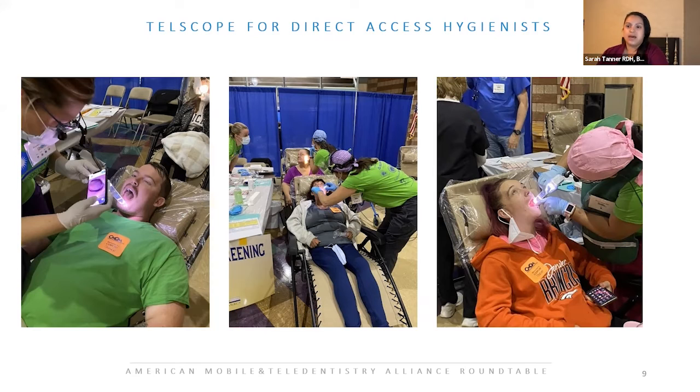At one point, I was like, Mike, okay, there's something going on behind the uvula when the patient says, I'm able to see it. But when she relaxes, I'm unable to see it. So I was like, is there another function to this? And he's like, oh yeah, there's a video function. And I was like, sweet, how do we use that? And he's like, well, I wasn't planning on going into that. And I was like, well, I'd like to go into that and know how to use it. So being able to dive in real world with the TelScope here with Susan Cotton was amazing. I think I used it on every person in my chair, and I just got so used to it.